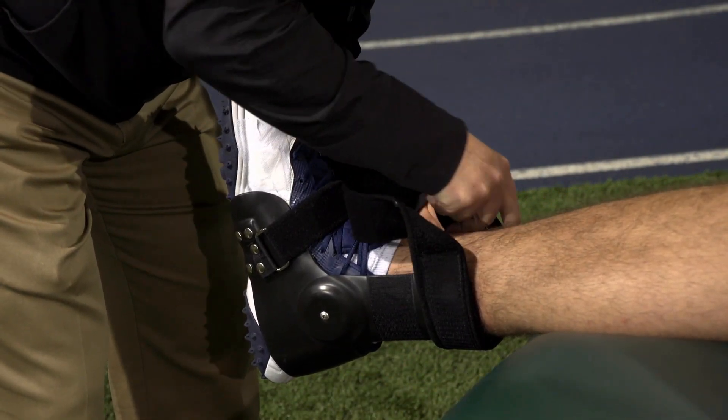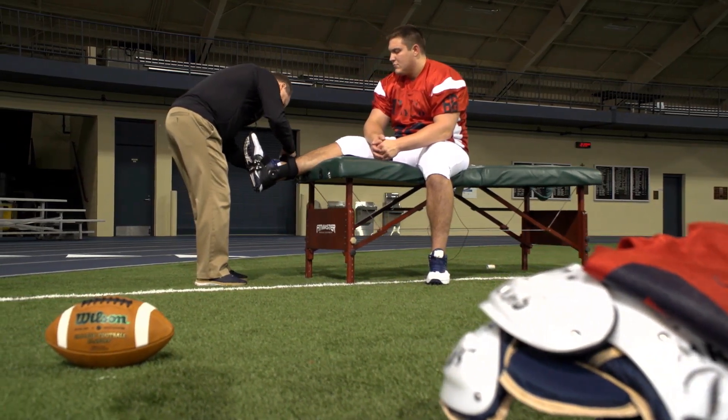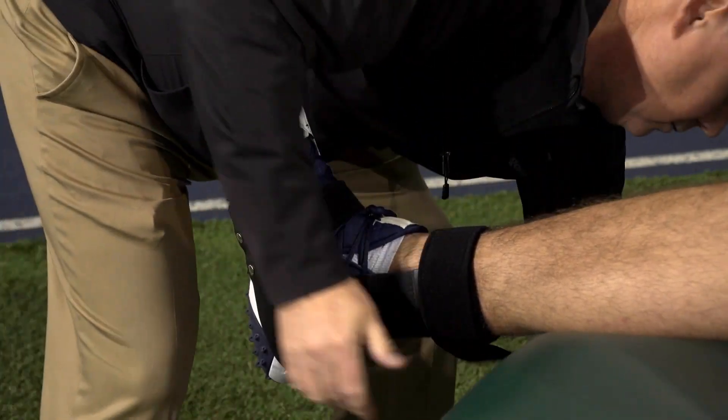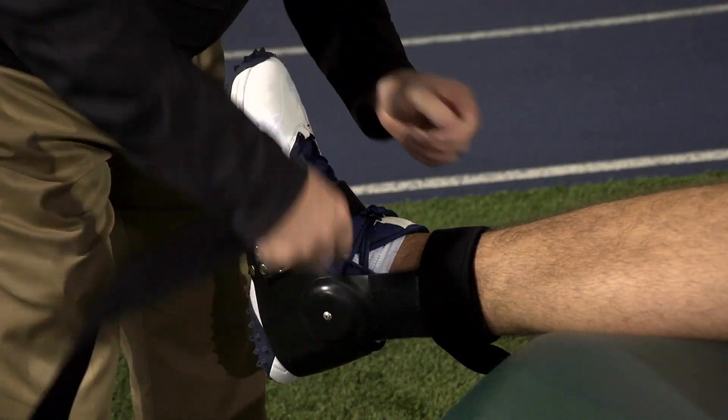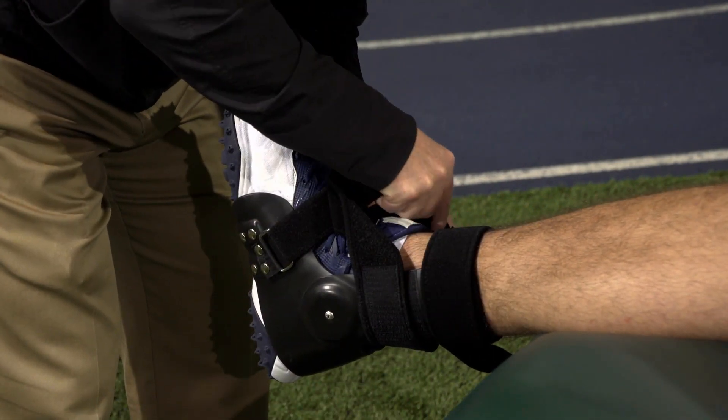Step 4: Secure the uprights with the Velcro D-ring strap. D-ring placement is on the medial or inside upright. Pull the strap around, behind and around to the front of the ankle, running the strap through the D-ring and back onto itself and the Velcro portion of the strap.